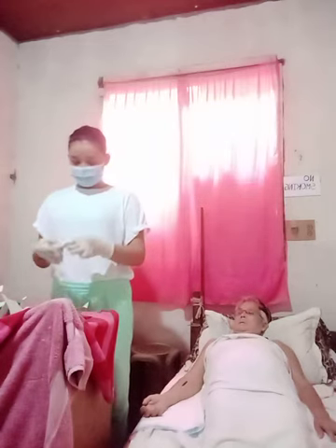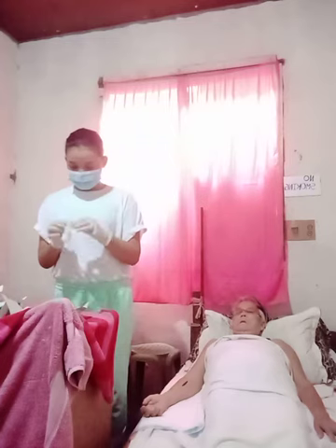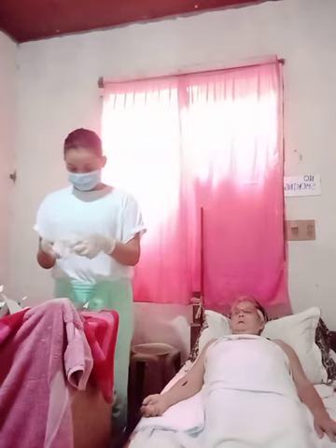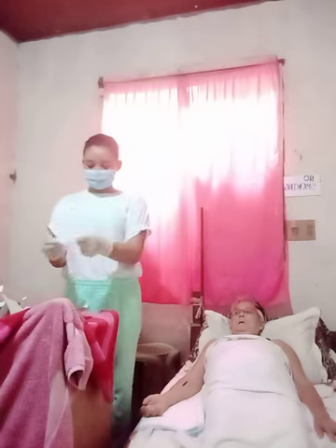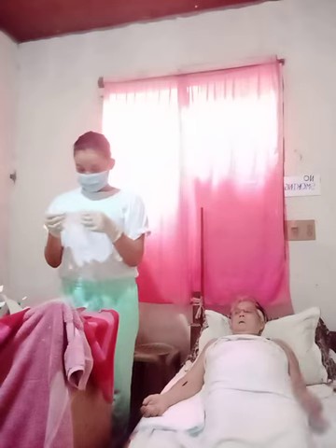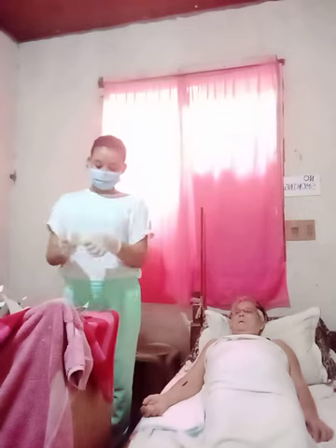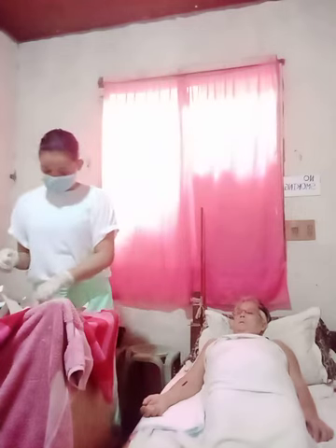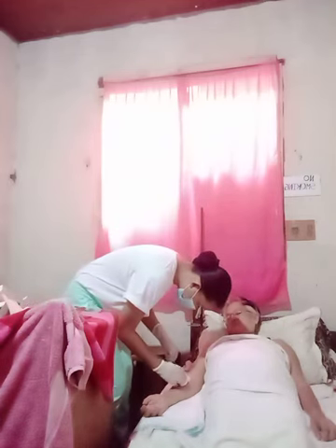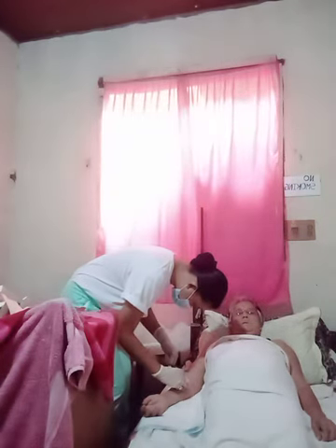Now, like this. Spread the gauze wide. Then, using my forceps, I'm going to put this here, like this.